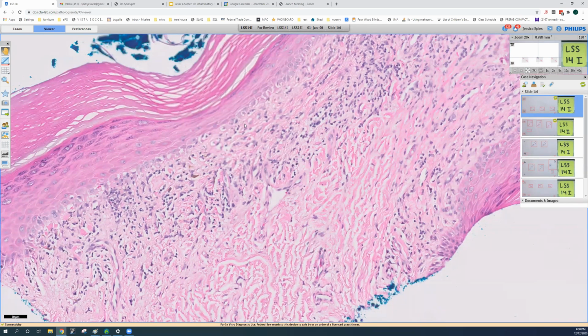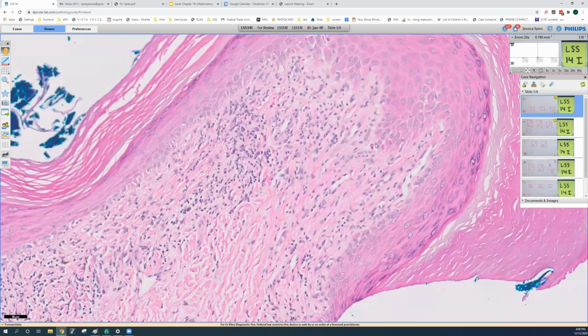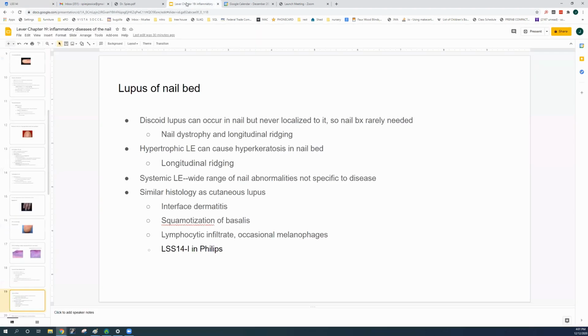Lymphocytic inflammation, we should have some kind of smudging of the basement membrane zone. That's prototypical for collagen vascular disease, especially lupus, some occasionally necrotic keratinocytes. There is some very mild spongiosis, but this is not a spongiotic dermatitis. And then some melanophages here. Next slide.